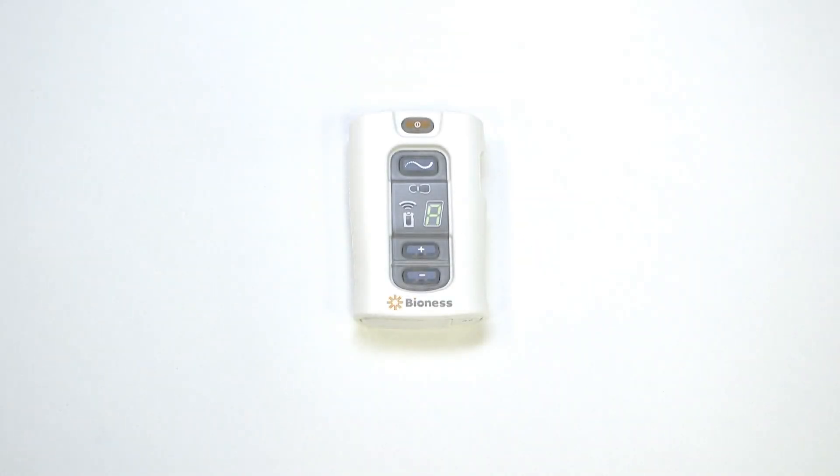When there's a faulty electrode contact, the EPT icon will blink red and the intensity value will blink on the display.